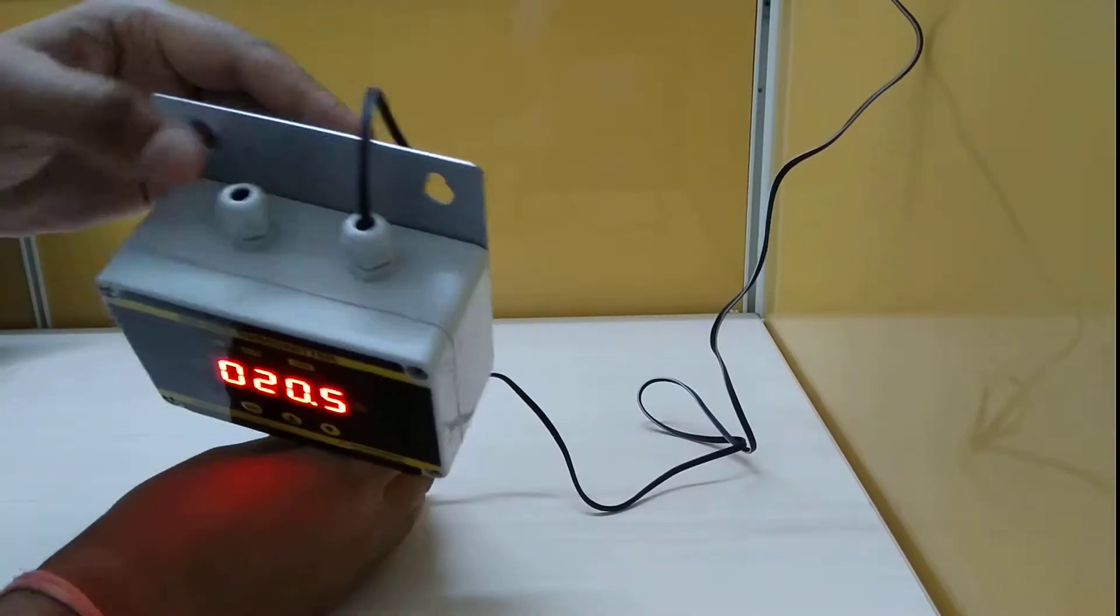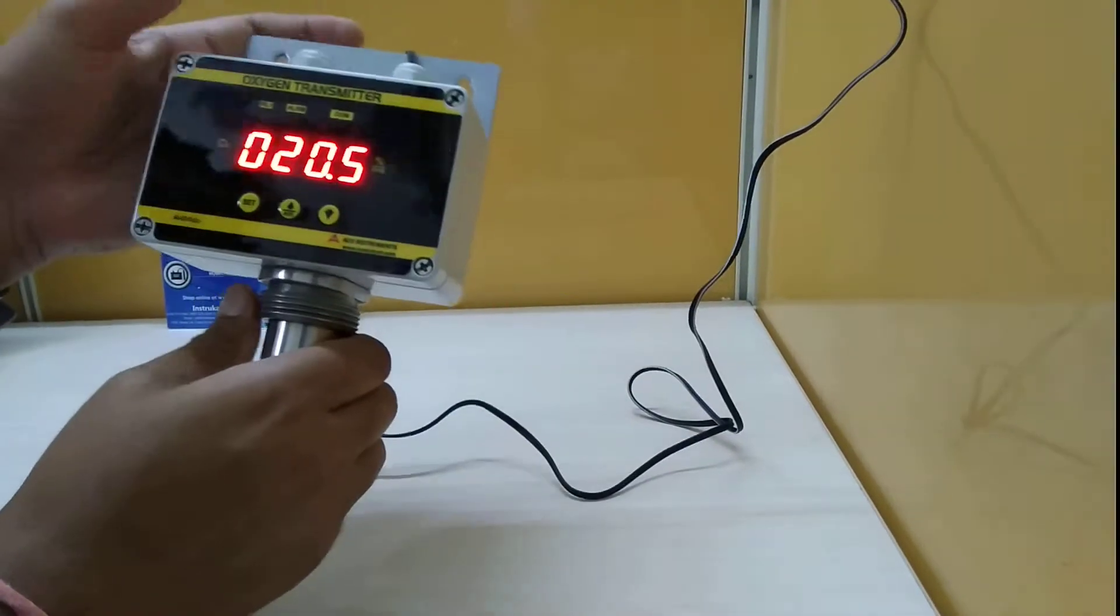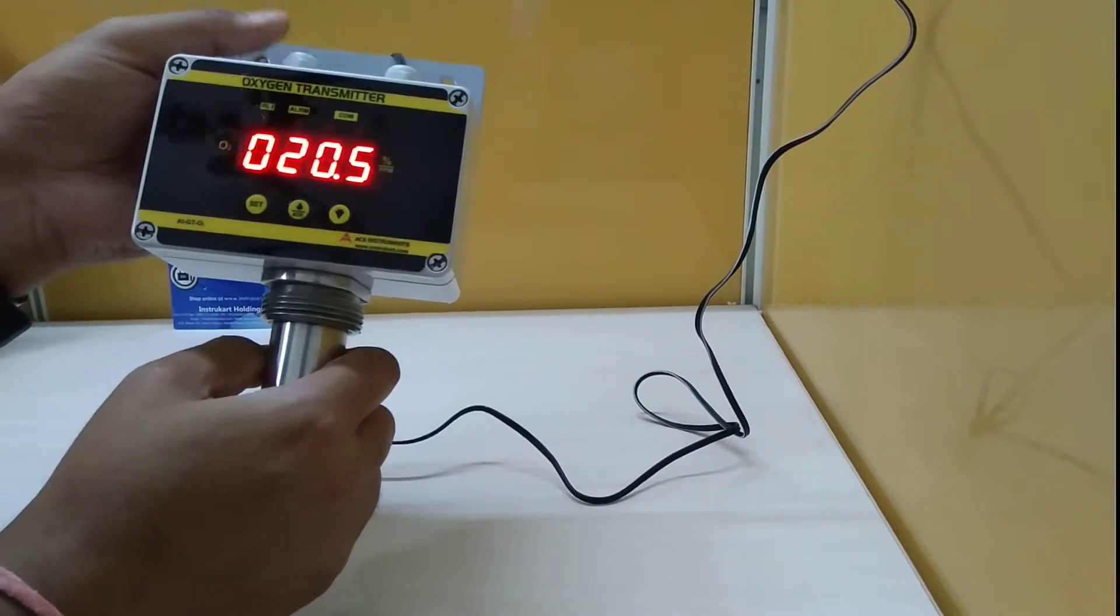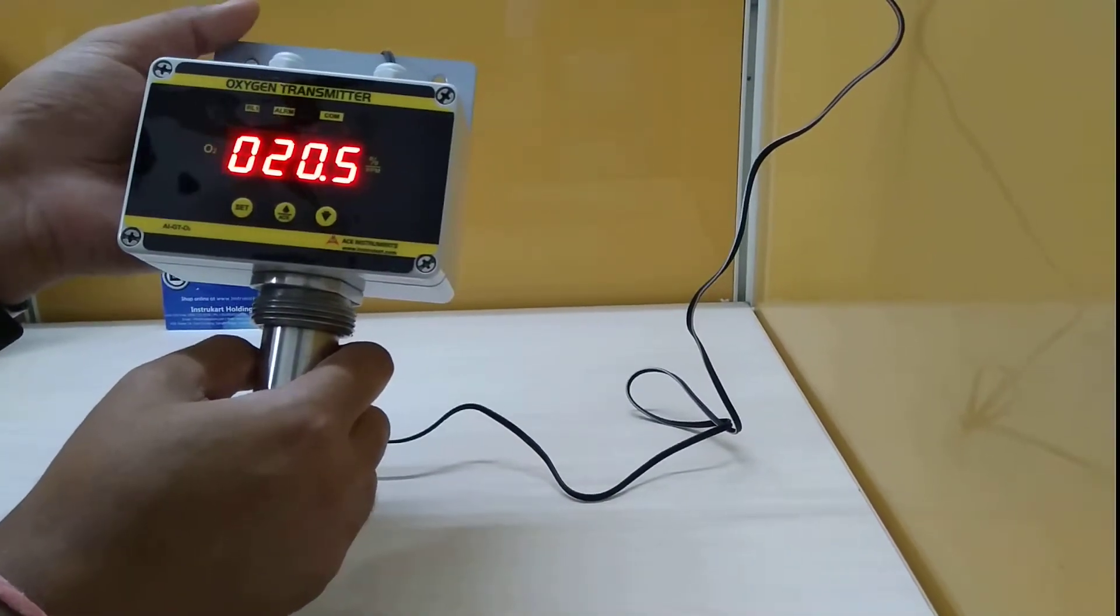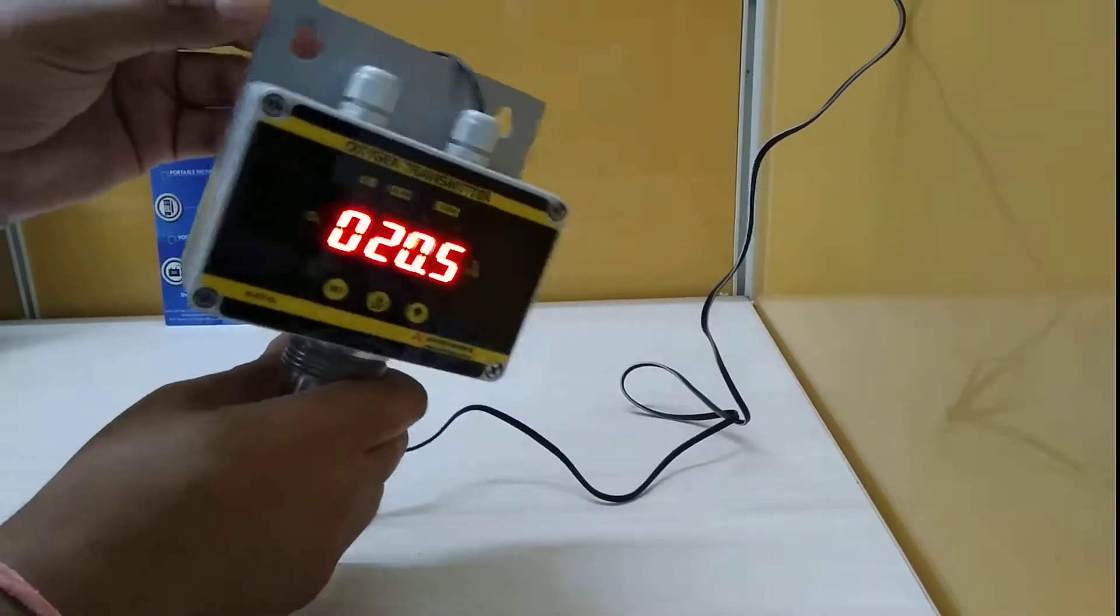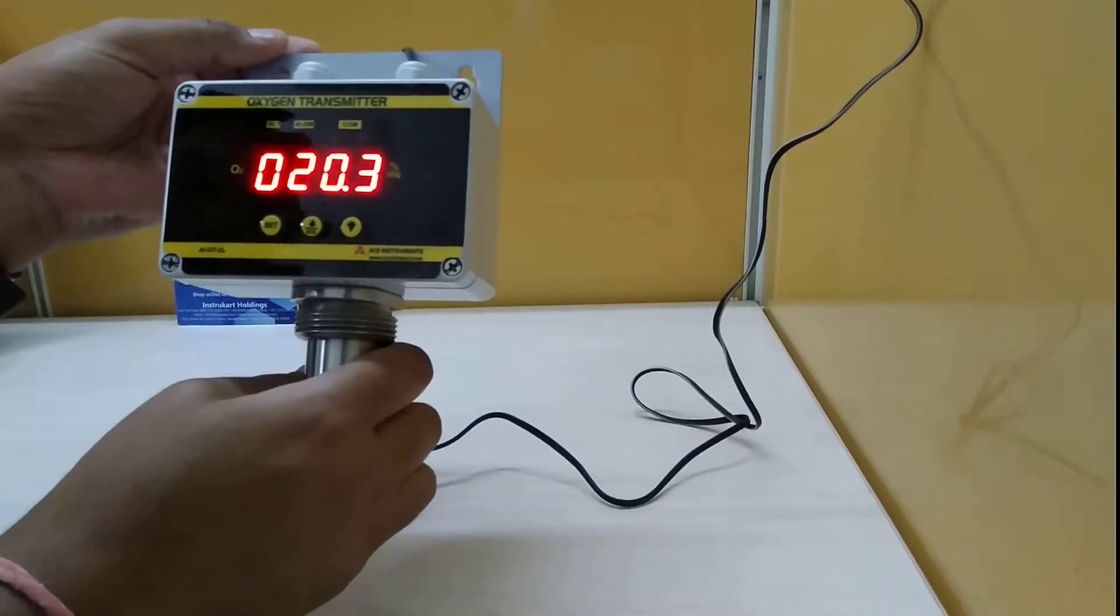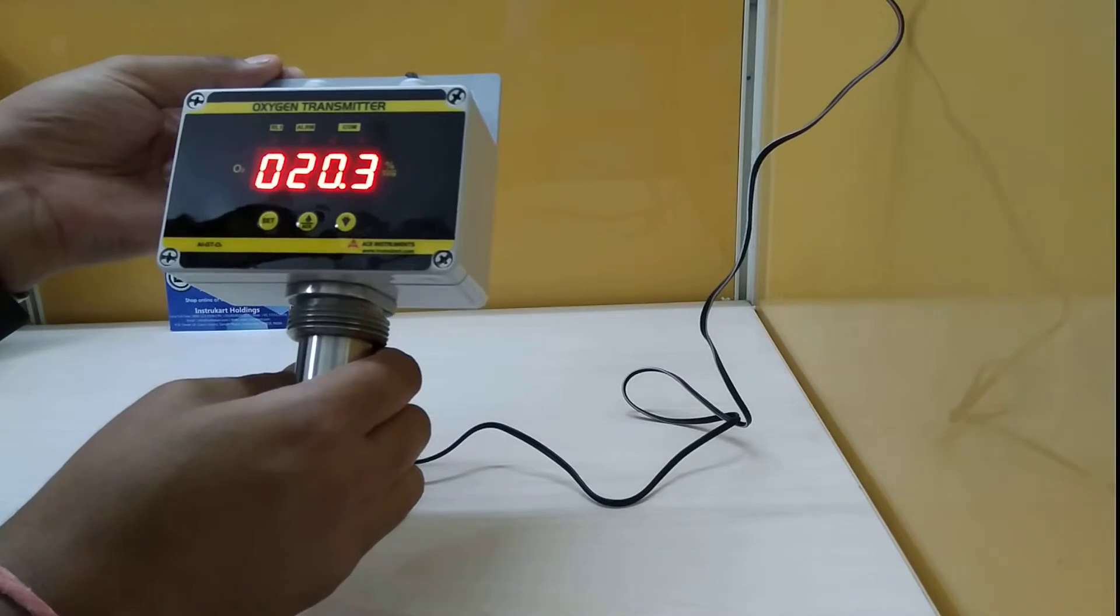This gland is used for communication connections. The instrument has communication options including 4 to 20 milliamp and RS-485 Modbus, which can interface with your PLC via SCADA. You can integrate this information into your BMS system.